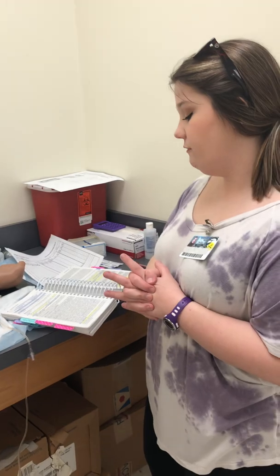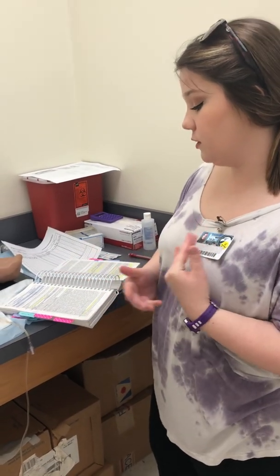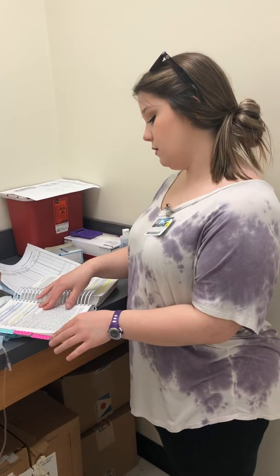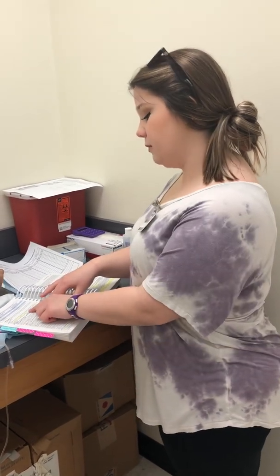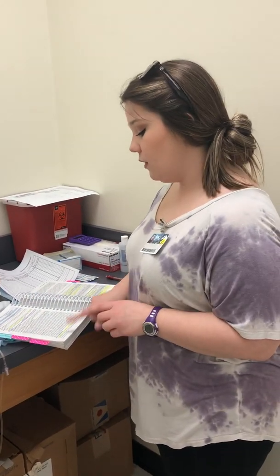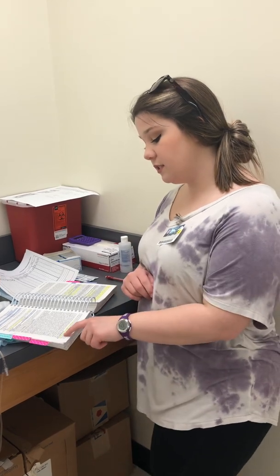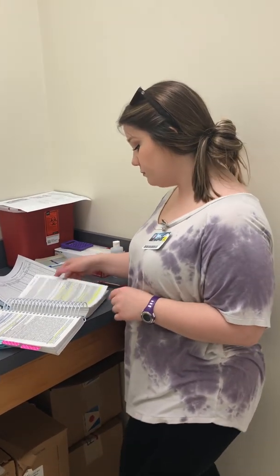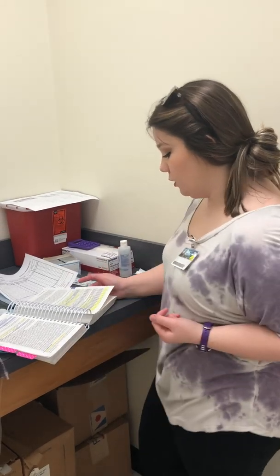okay, it says further dilute each single dose into 50 to 200 milliliters of normal saline or D5W, which I know is correct because my book states it. And I also know it's compatible already because it says here that I can mix it with D5W. The rate of administration, it says each single dose properly diluted over 30 to 60 minutes, which I'm going to use 60 minutes because it is the safest for my patient. And now I'm looking at precautions.